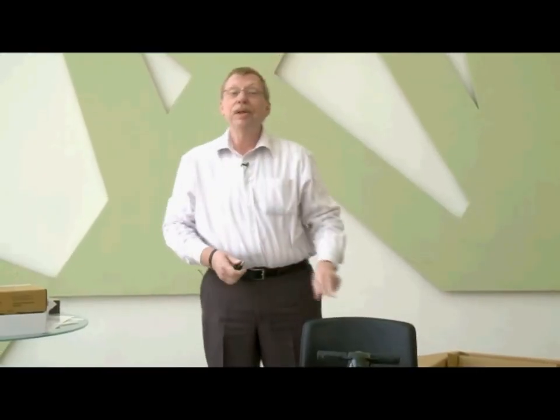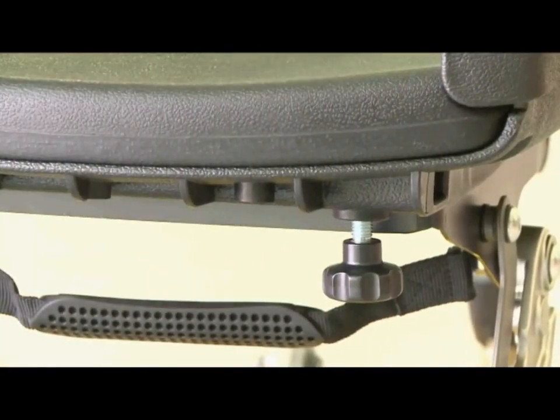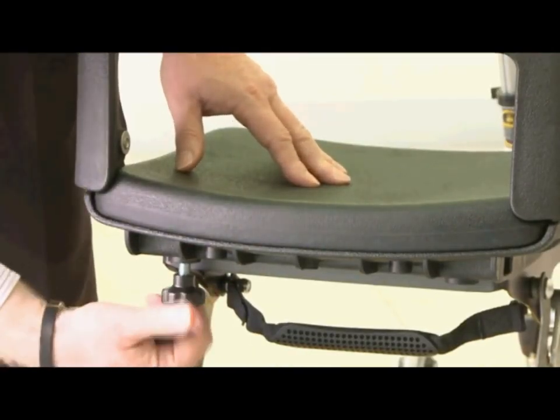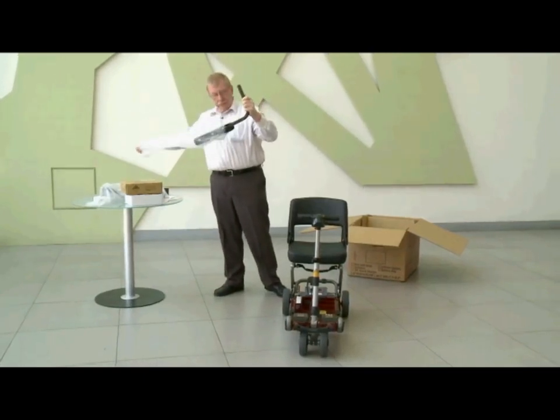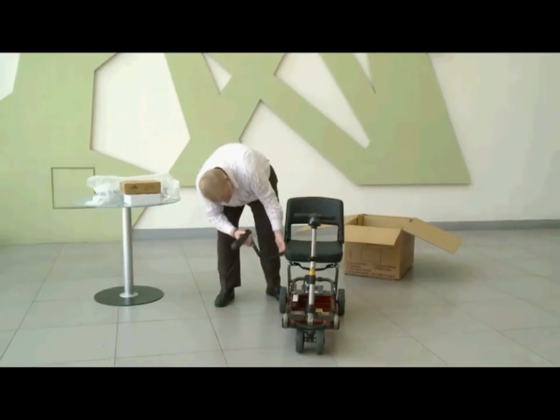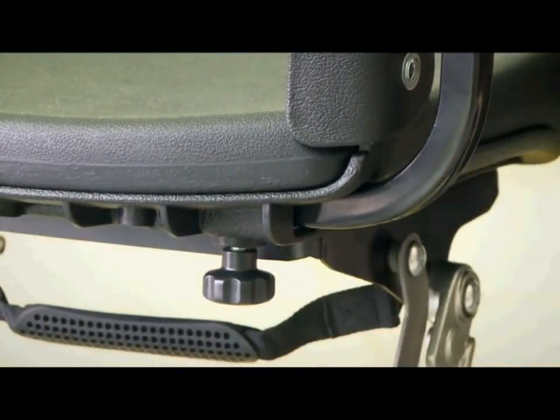Now we're going to put the armrests on. This comes with two screws — they get installed underneath the seat. Get them started but don't tighten them completely; there's one for each armrest. Take one of your armrests out of the bubble wrap. This is the right one — there's a square hole in the side of the chair that this slides into. Once you have it in position, just tighten the nut.